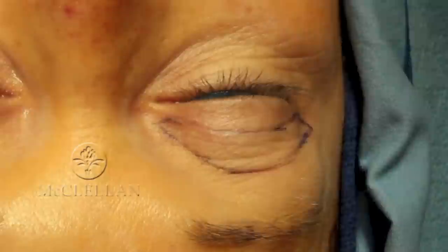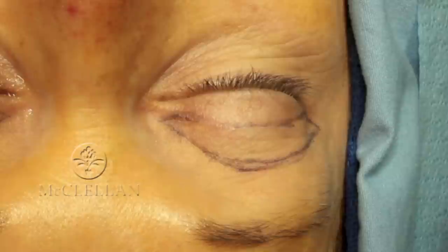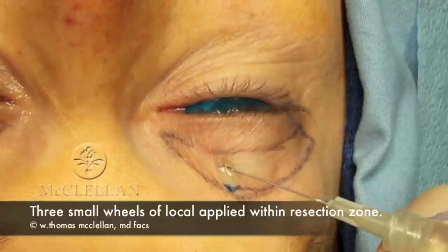Once I finish the marks, with a small forcep, I just pinch the skin together to show that I can remove the skin safely. Then I inject with 2% lidocaine with epinephrine three small wheals of local anesthetic within the area that I'm going to resect, for hemostasis as well as analgesia. Then I wait 5 to 7 minutes for the epinephrine to take effect prior to making an incision.